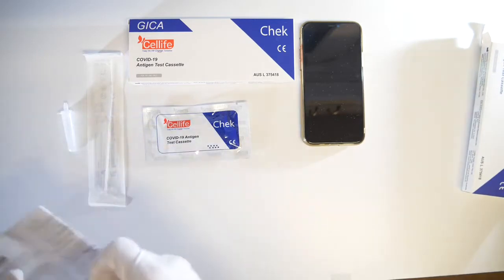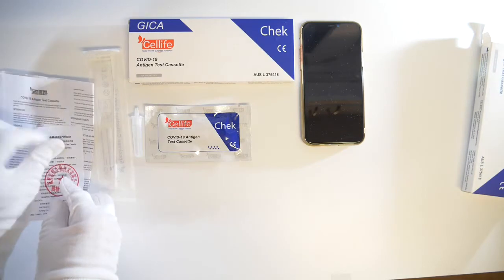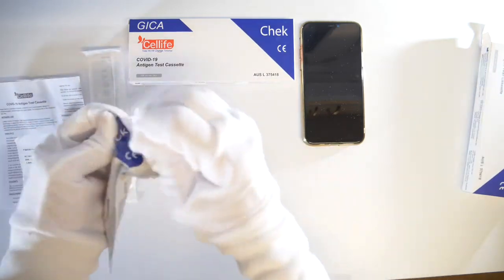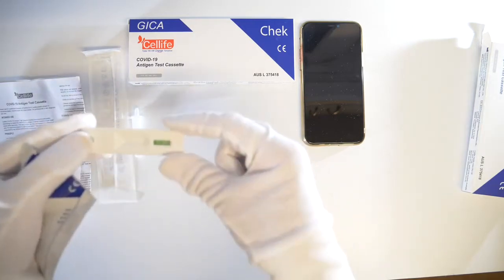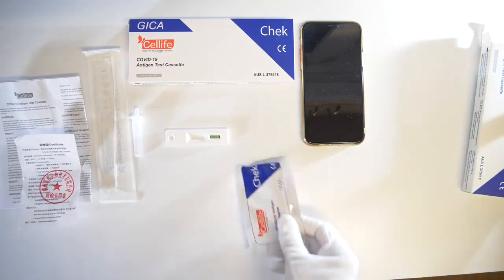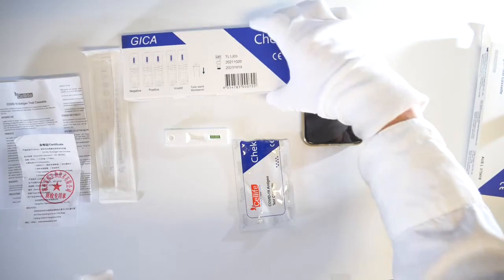After reading the instructions, prepare the test cassette. Place the extraction tube containing the buffer solution in the well provided on the back of the Cell Life box.